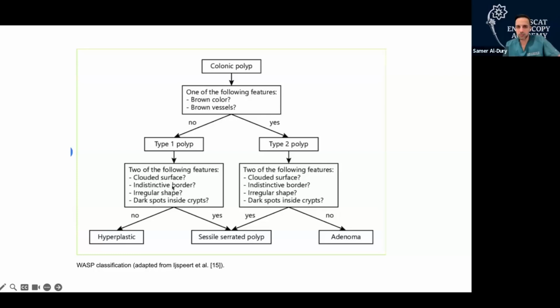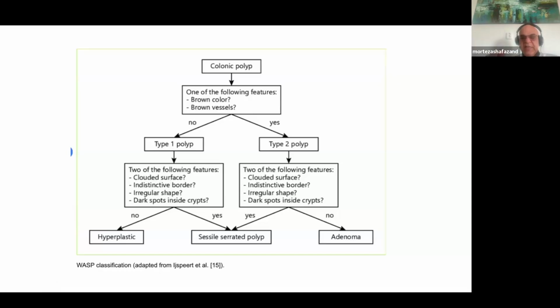And also I would say when you come to the right colon, you have the liquid at the medial part. So imagine you are in the cecum. You put the patient in the right side position to see the cecum best, right? And all the liquid goes to the lateral side, which is mostly the opposite side of the ileocecal valve.